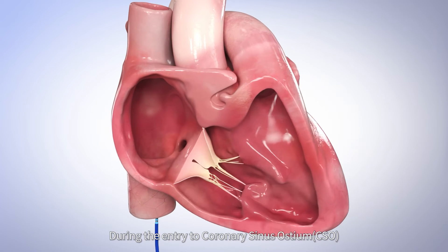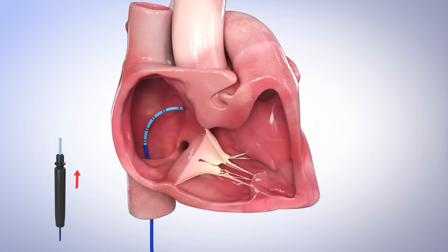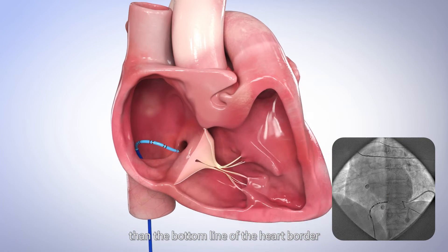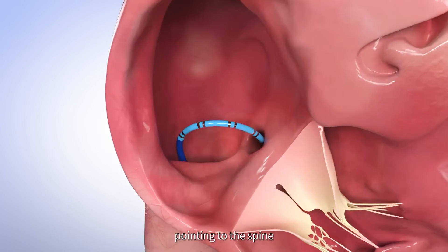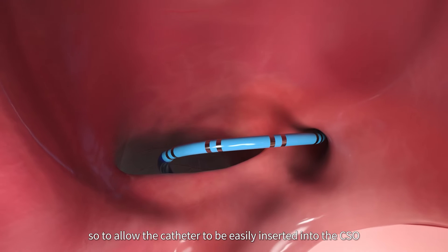During the entry to the coronary sinus ostium, at LAO 30 degrees, curve the tip and direct the catheter horizontally to the position one vertebra higher than the bottom line of the heart border. Then rotate the handle clockwise, pointing to the spine, so to allow the catheter to be easily inserted into the CS ostium.